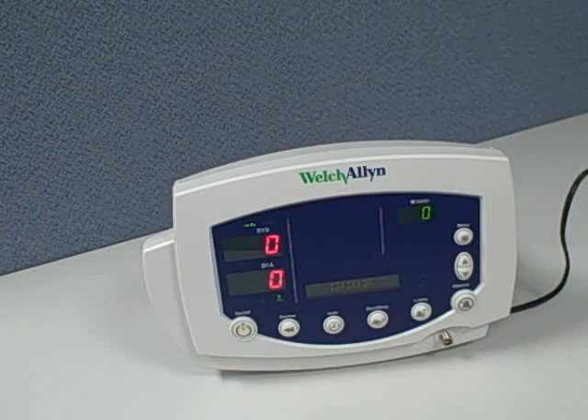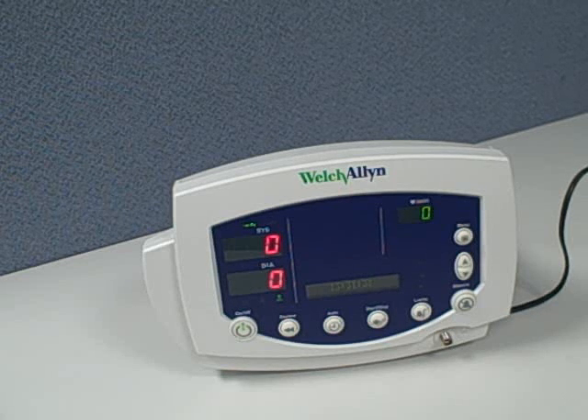The VS300 Vital Signs Monitor is more advanced than the Spot Monitor by Welch Allyn in that it includes continuous monitoring of the parameters, and is below the Atlas series of Welch Allyn, which includes ECG waveform.